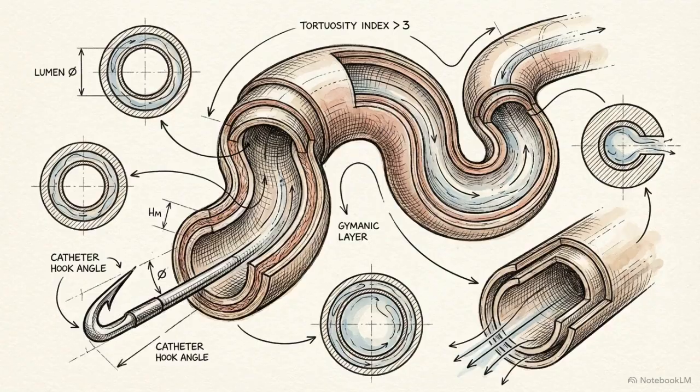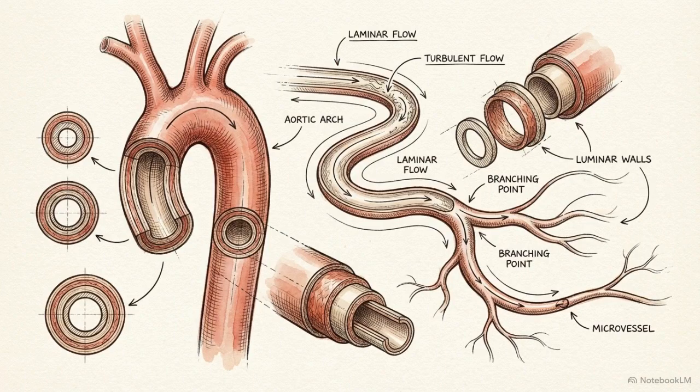Beyond fluid dynamics, selective catheters present a physical steering challenge. Navigating from a main artery into a specific branch requires matching the tool to the patient's anatomy.